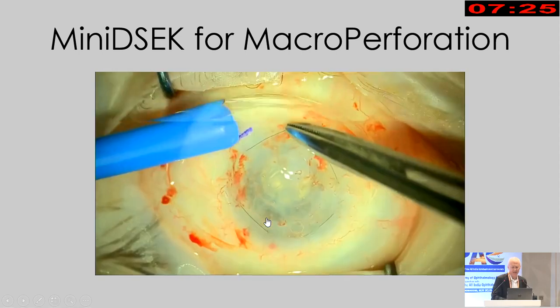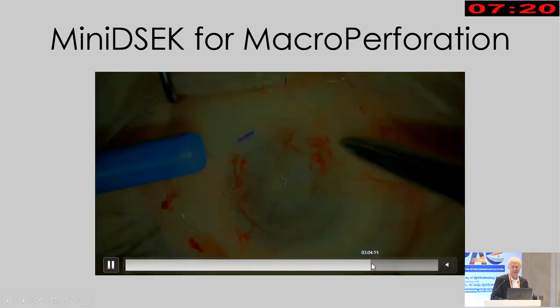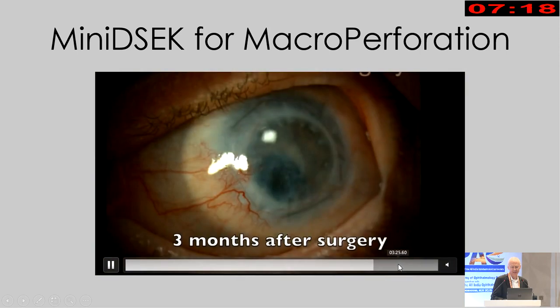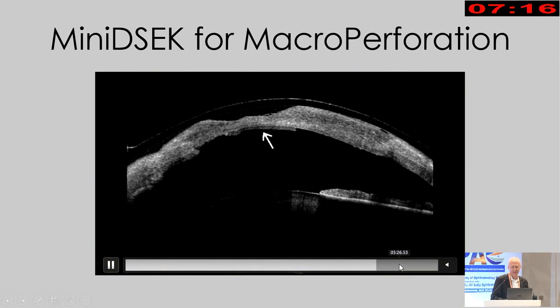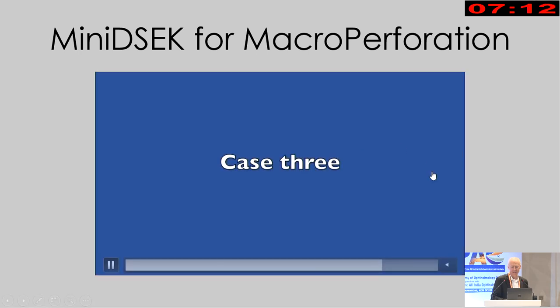I'll skip this on a bit because I want to show you the mattress suture in the third case we've got. I think that we've got that here. There we are, thinner graft. And I think I can fast forward here. I'm going to try.